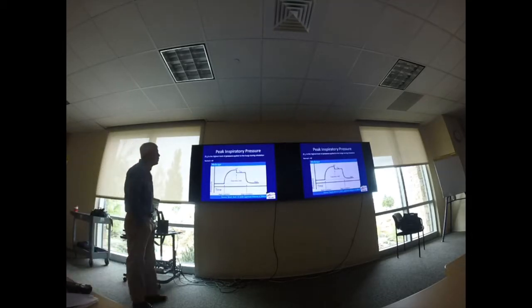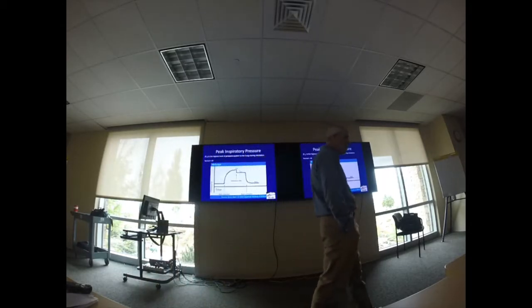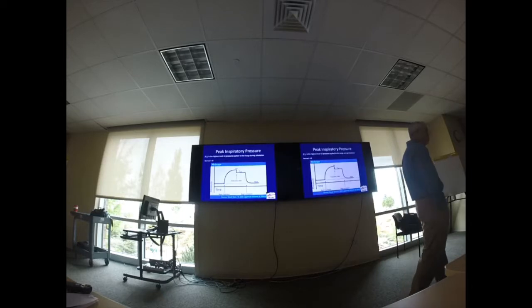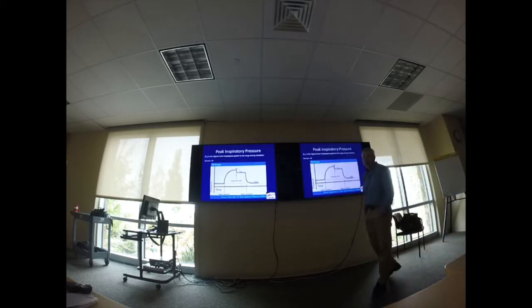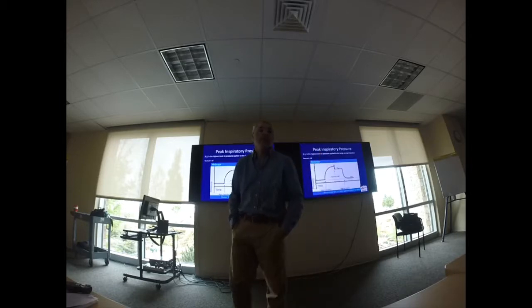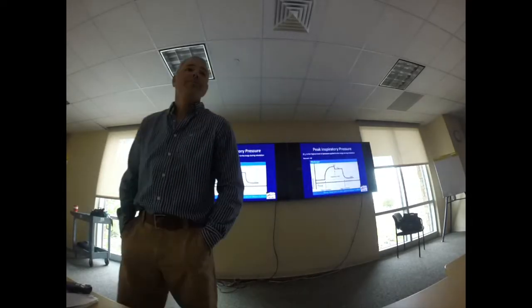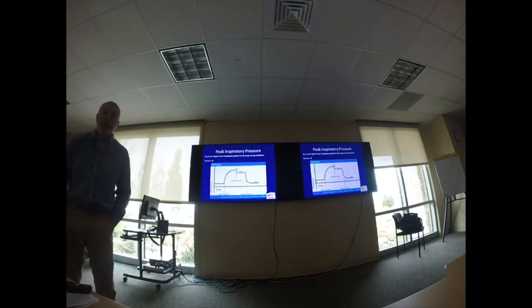lungs during inhalation. A normal peak inspiratory pressure shouldn't be greater than 40 chronically, all right? What I mean by that is occasionally somebody can have an increased peak inspiratory pressure based upon certain things. So what would cause an increased peak inspiratory pressure? You guys tell me. Mucus plug would cause it, right? So chronically it shouldn't occur, right? Because what are you doing with it?